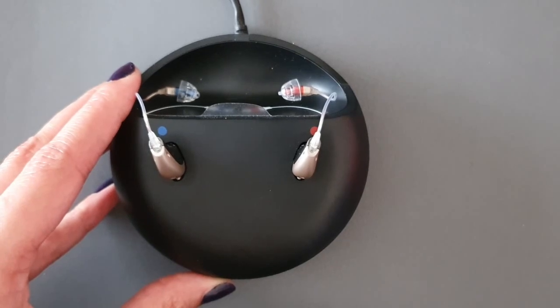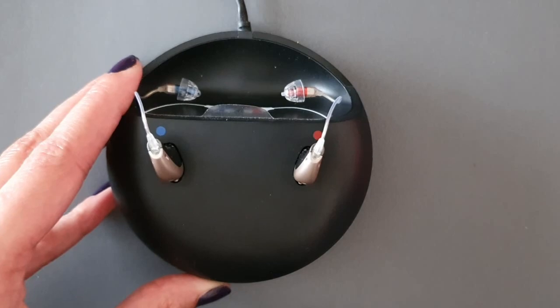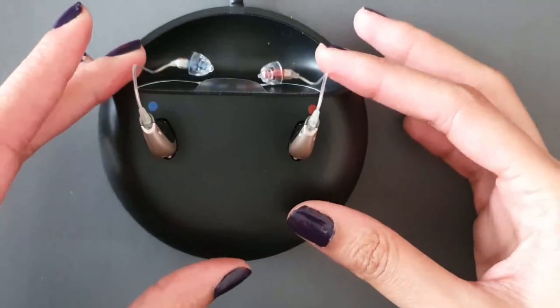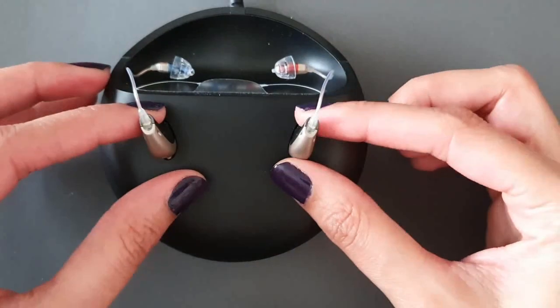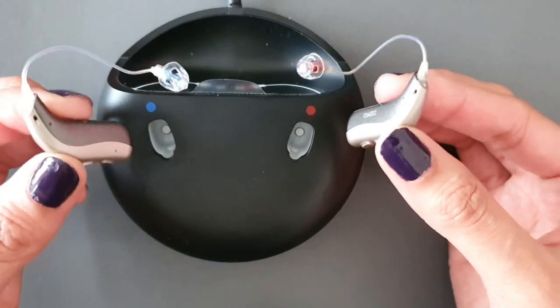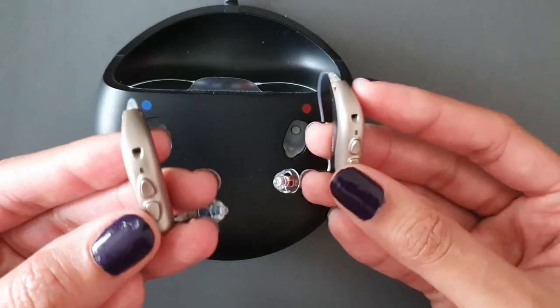The charging process will automatically stop when the battery is fully charged, but leave the hearing aid in the charger when not in use and always keep the charger connected to a power source. Whilst the hearing aids are inside the charging dock they are automatically switched off, and in the morning when fully charged and you pull them out, they automatically switch on.